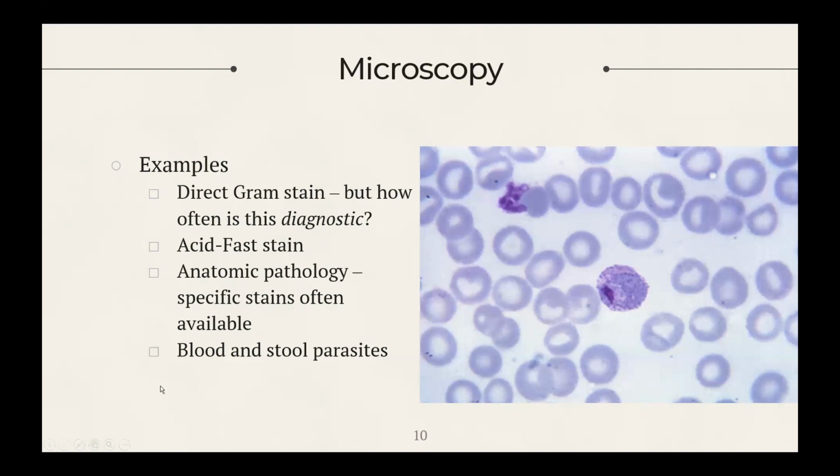Sometimes microscopy is the gold standard, the way to do things, especially in parasitology. Like this slide right here, this is the standard way of diagnosing this disease. You look at this and say, okay, this patient's got malaria and it is caused by Plasmodium vivax. So we've got pretty much almost everything we need to know just from doing that one smear.